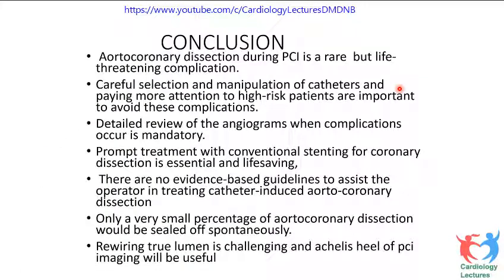So to conclude, aortocoronary dissection by guide catheters is very rare, but be careful, it's life-threatening. Careful selection and manipulation of catheters is very, very important, and reviewing the angiogram is very, very important. Diagnosing the dissection is the first point of your treatment. If you fail to recognize it, or recognize it late, you will lose the patient. So you should recognize it very fast. That is very important. And prompt angioplasty and stenting saves a lot of lives.